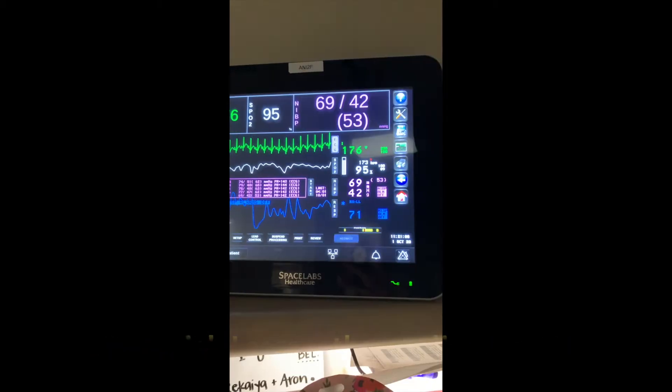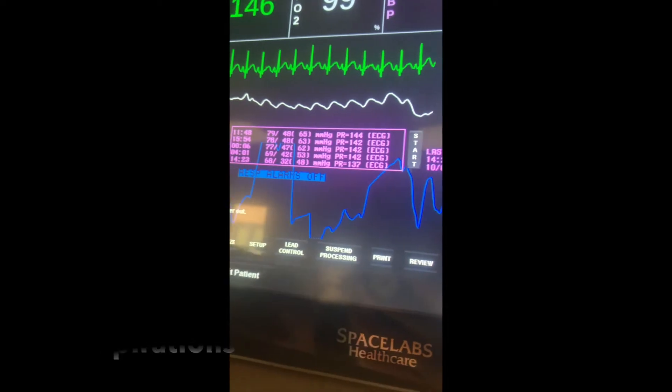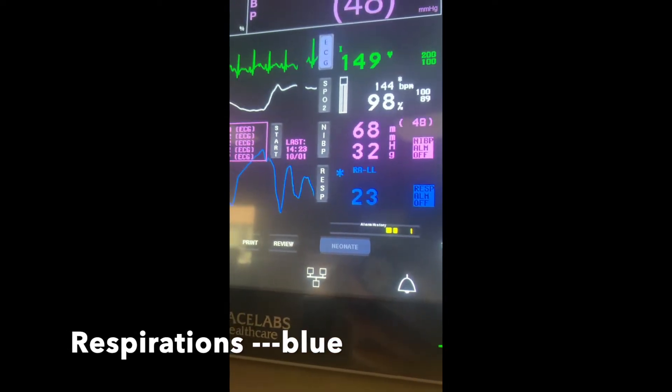The number over here is the blood pressure. The respirations are shown in blue, they kind of go all over the place, and that number represents the respirations.